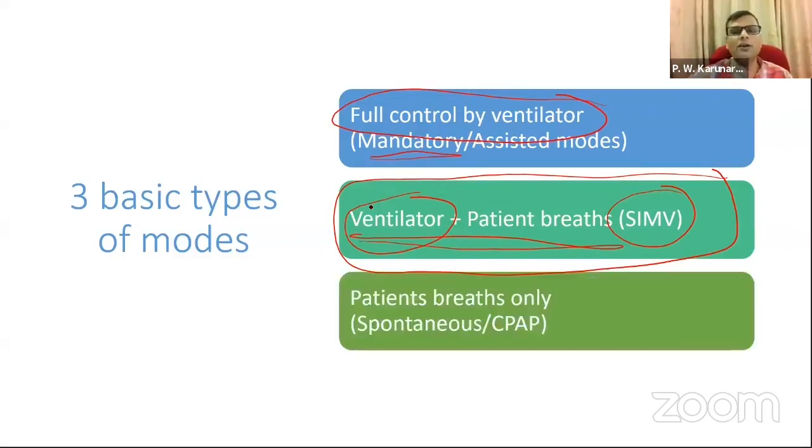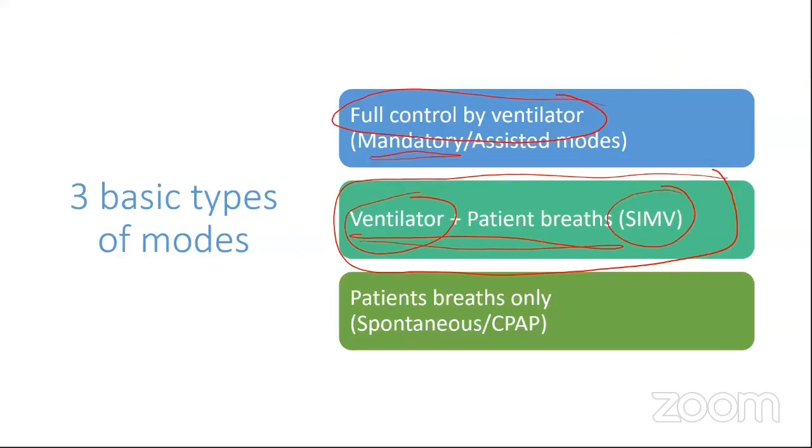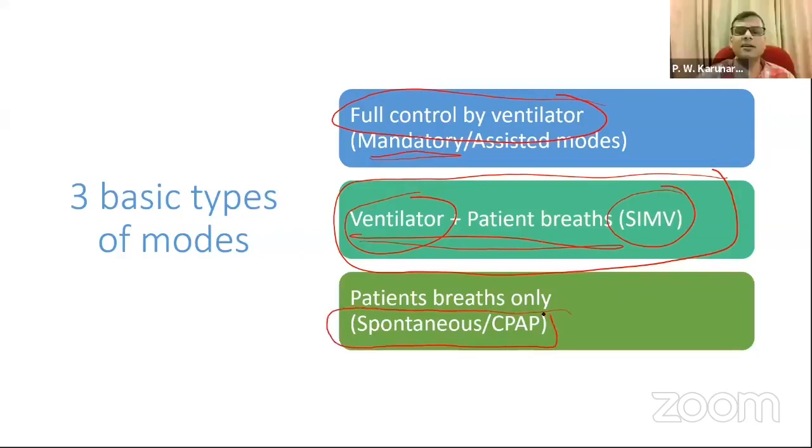And there is another mode for when the patient is strong enough, where the patient manages all the rate and how the patient breathes. That's called the spontaneous mode. There are so many names: CPAP mode, spontaneous mode.